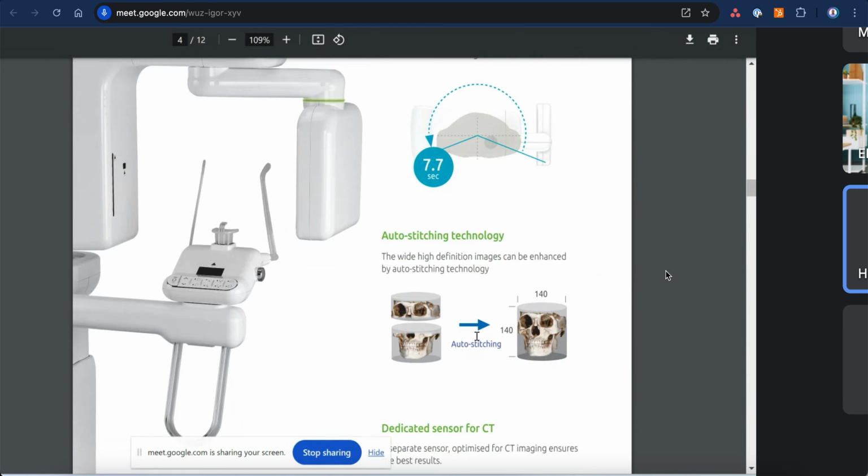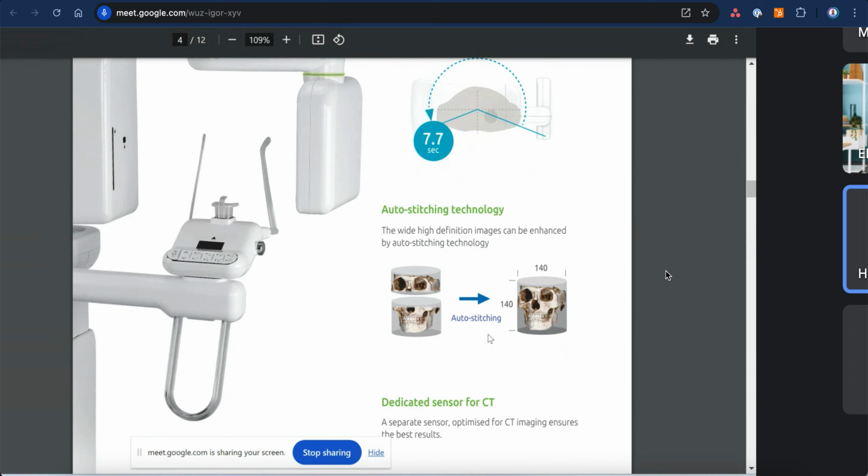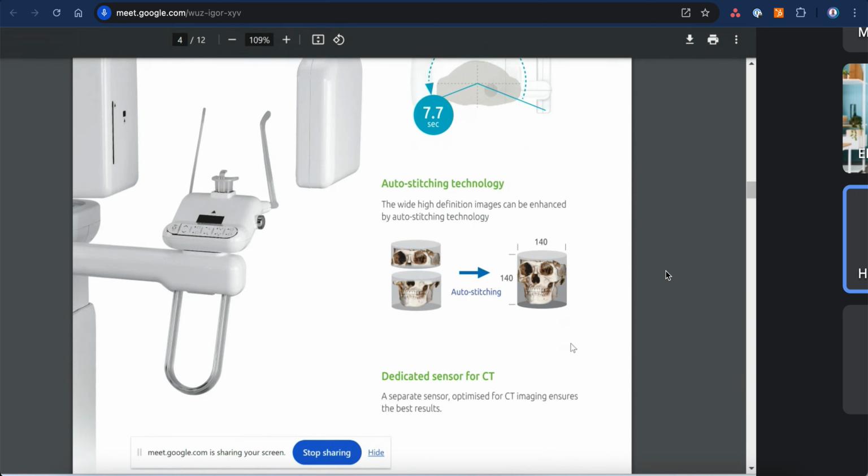This technology also provides something called auto-stitching. For example, if I want a very large field of view, I want the whole face from the chin to the top of the head, the field of view of this thing doesn't cover all that I want. So I can have two images, like I can have this one below, and then I can have this one alone. Then I can do stitching. I join them together to have this max dimension, 140, and the other is 140. So I combine them, and it doesn't lose any kind of information. I do the stitching thing.